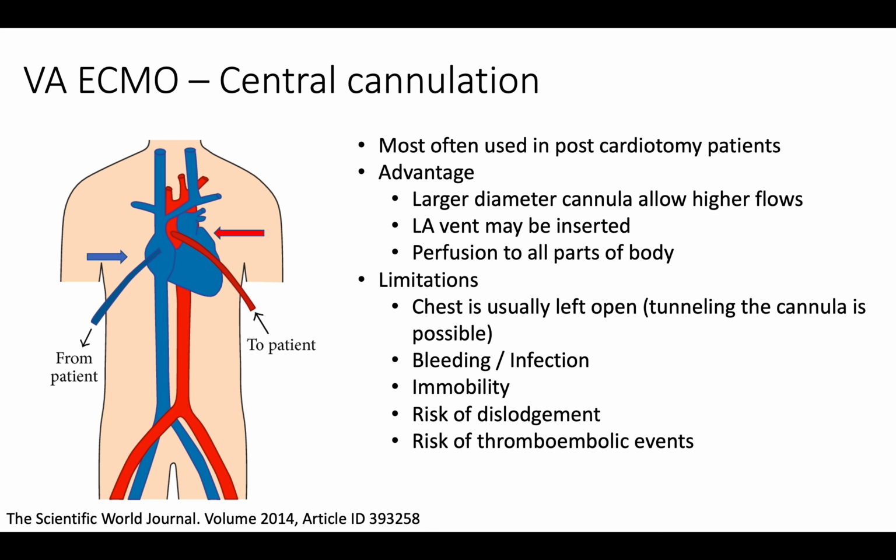This can happen in a significant proportion of patients with severe myocardial failure anyways, but this will be aggravated by higher ECMO flows. In this case, left side decompression may be required. Another advantage of central cannulation is that it allows direct left atrial venting to decompress the left side if required. If the team anticipates the above scenario, the surgeon can insert a vent directly into LA during implantation of cannulas through central approach.